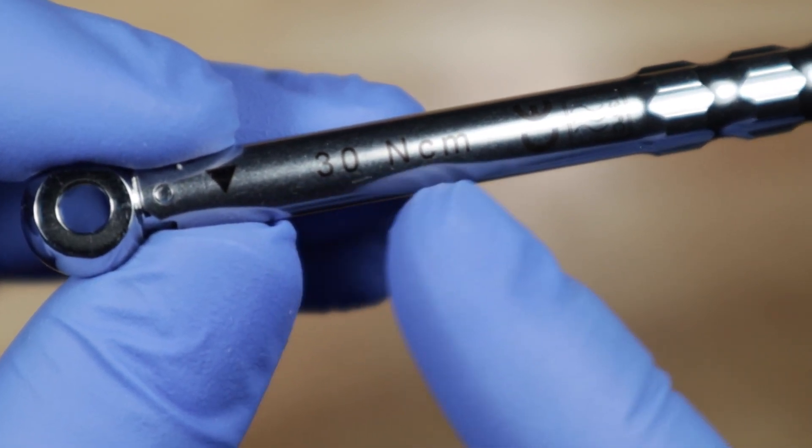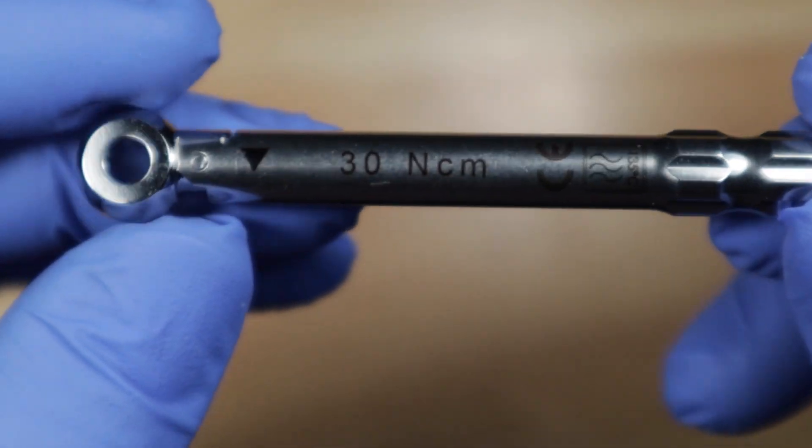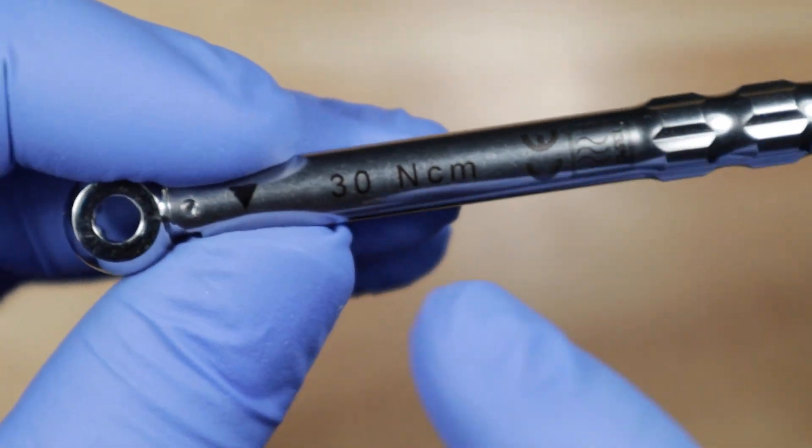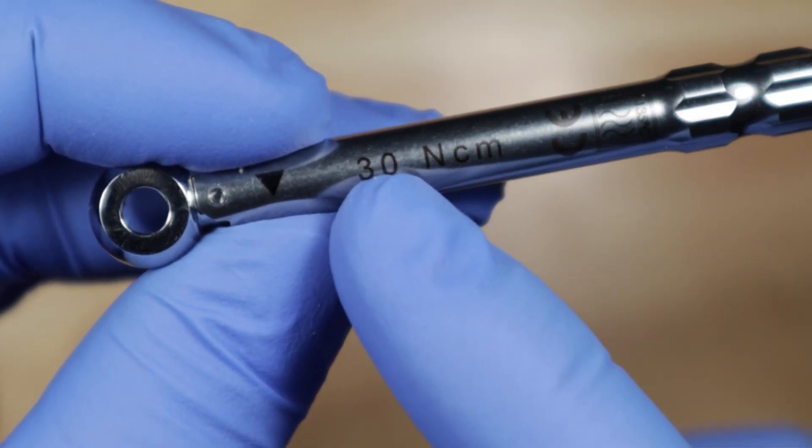It's already calibrated at 30 newton centimeters so you don't have to mess with the torque or anything like that. It will automatically take the screw to 30 newton centimeters only.